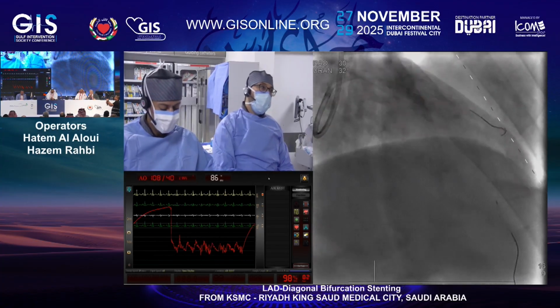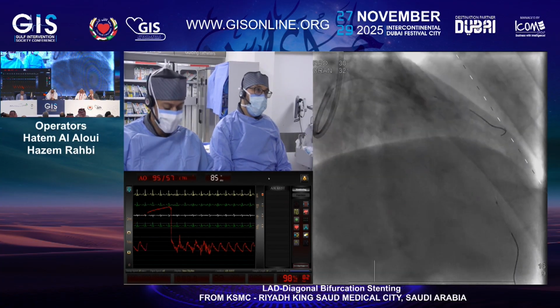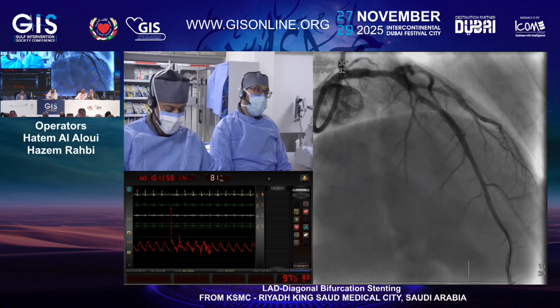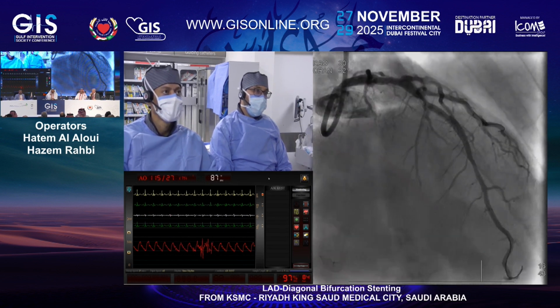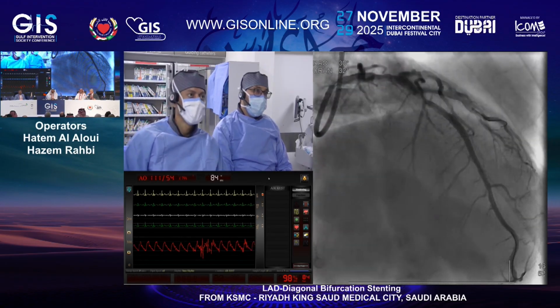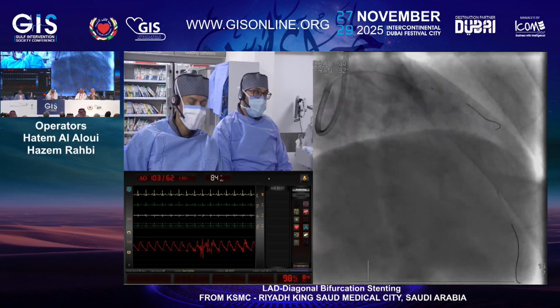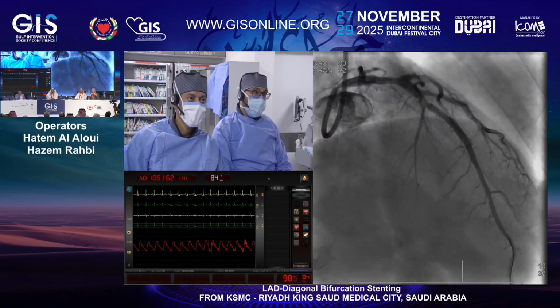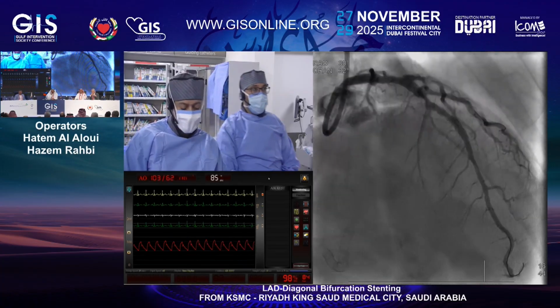What do you think again on the proximal lesion here? It doesn't look nice. I mean, it's a mixed opinion here. Personally, I would just stent across the diagonal, not go back to the ostial LAD. Some people will say, okay, go back, one stent, do the job back to the ostium of the LAD.